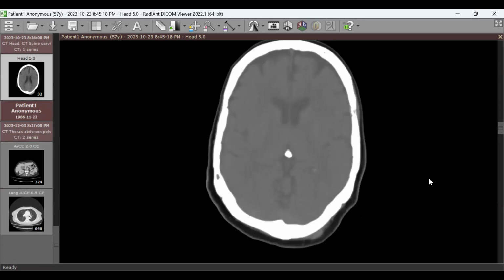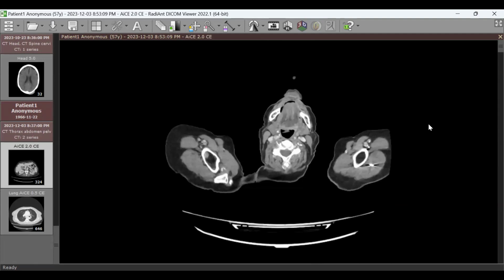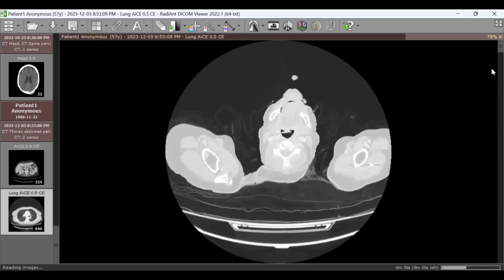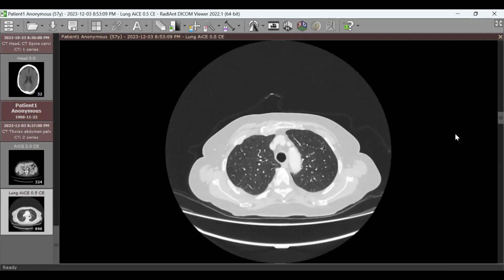Is this a metastasis? No, I think it's a site of trauma. It's a subgaleal hematoma that didn't resolve for 2 months. So definitely the suspicion was that we have something bad in the lungs. So we had a CT scan of the lungs.